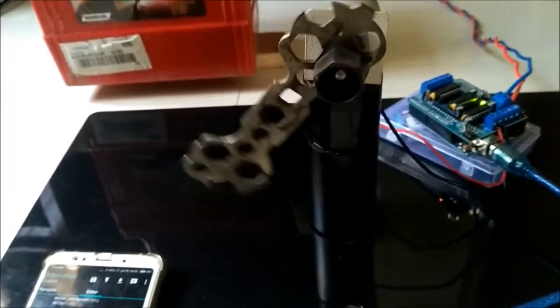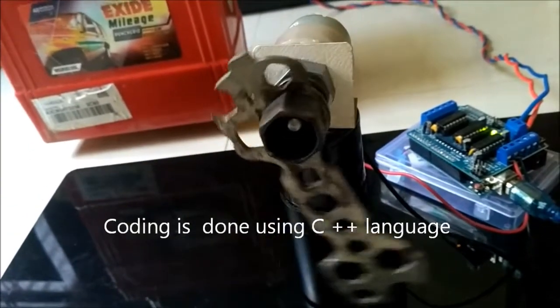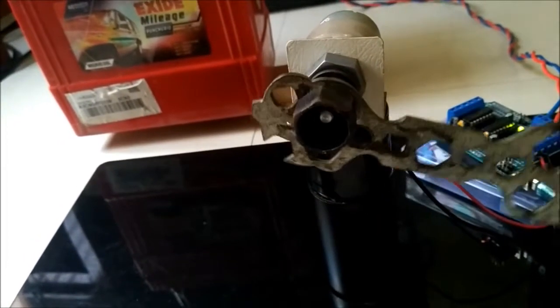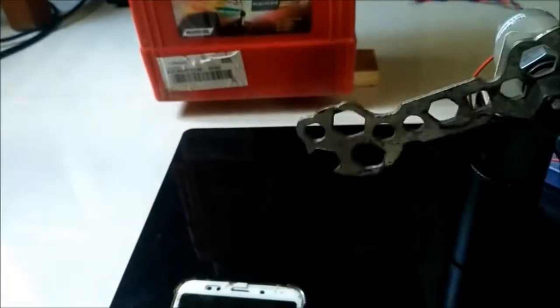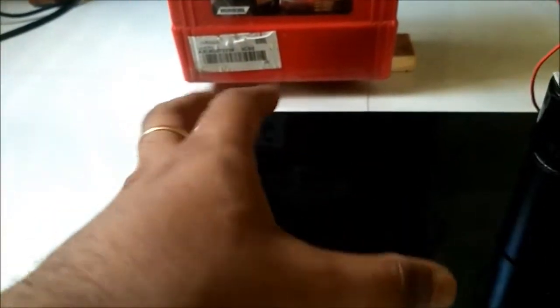So this is powered via the USB cable to the Android phone. You can see this is connected. Once the program has been done, you can remove this data cable and give a separate power cord to this board. Usually any program that has been written is fed into this Arduino board, and once the required code has been fed, we can remove this data cable and then power it through a separate power cable. So here, as you see, this oscillating motion is being controlled using this motor, and we can place the Ambu bag here so that this motion can help us to press the Ambu bag and supply the required oxygen to the patient.